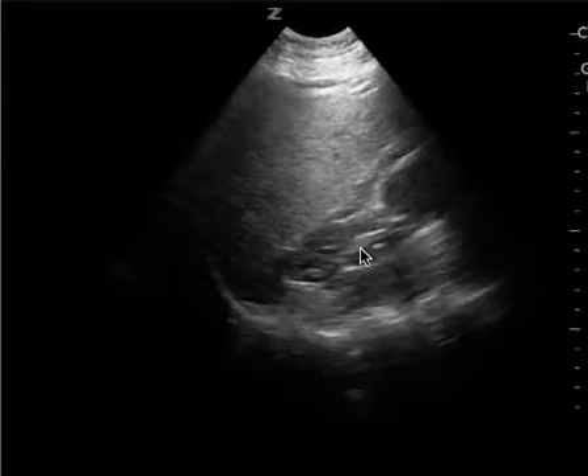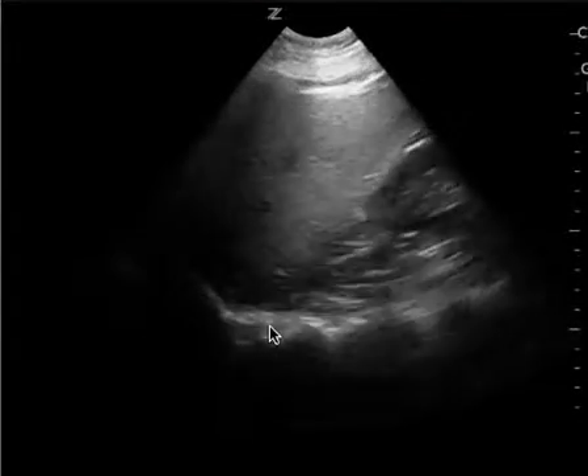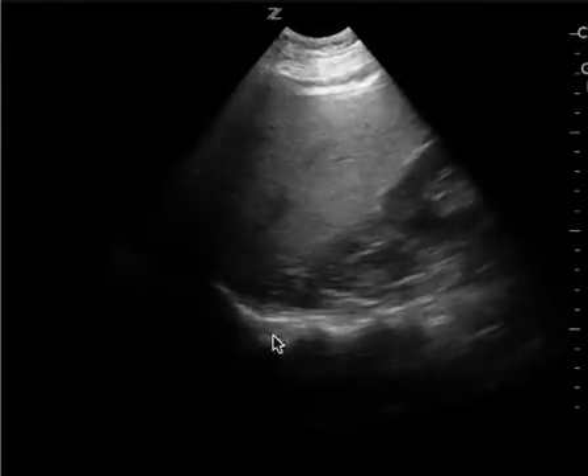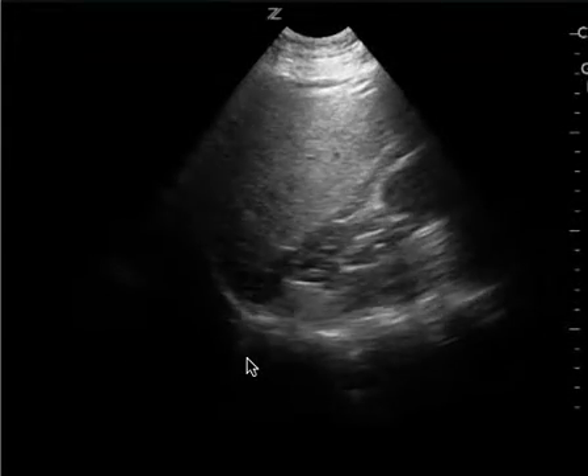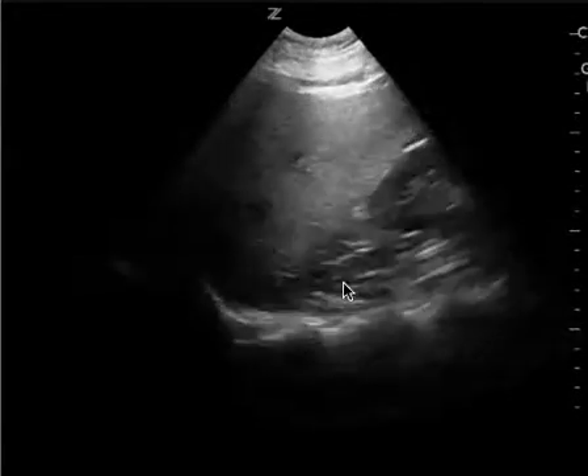This is a different patient, but this is an example of what I like to see in addition to the views that you obtain. I can see the spine, I can see the diaphragm really well, I don't see the spine continue, so I know there's no fluid in the chest, and so this is the more posterior portion of the FAST exam which I need to see.